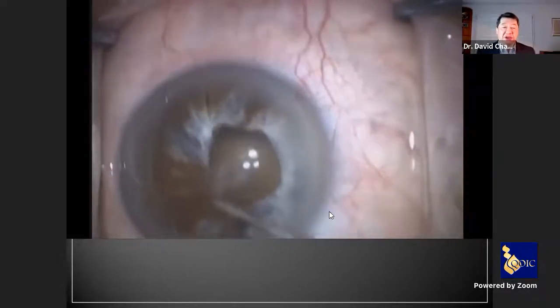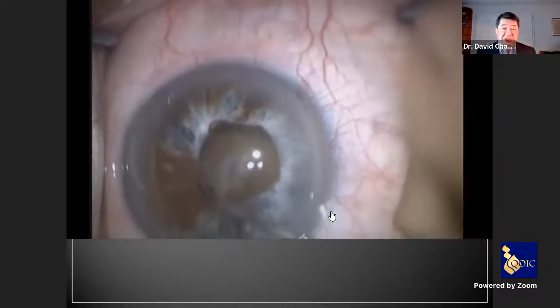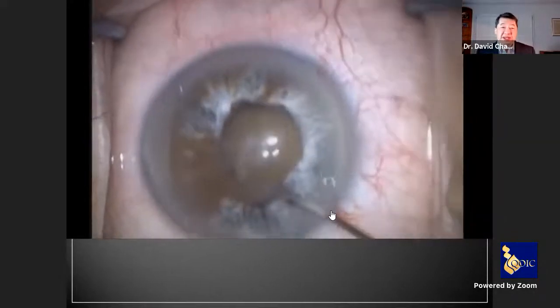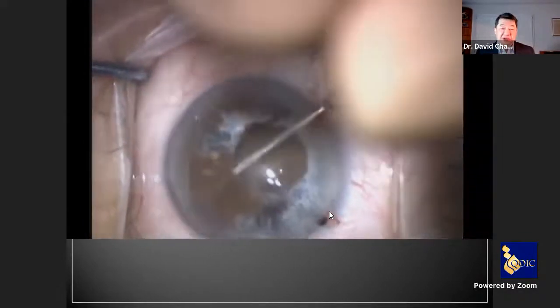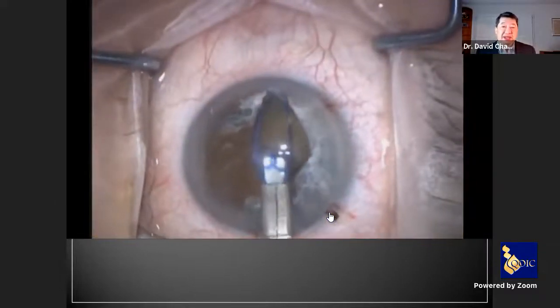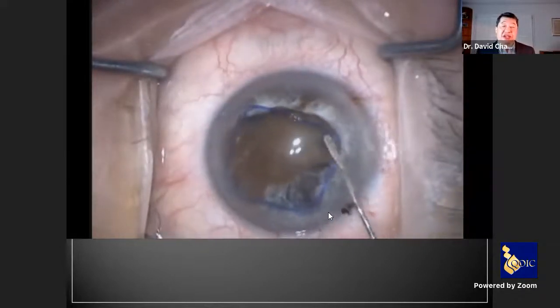Now the second challenge is we don't have just posterior synechiae. The iris stroma has been adherent to the lens because the lens is so forward. When I go in with the spatula, look at the bottom of your screen, you will see that it's very transparent. You see the spatula through the iris? That's how atrophic it is. So this is going to tear very, very easily, and that's why I'm not going to use iris retractors. I'm going to instead use a Malyugin ring because I think that while the case is going on, it's less likely that the pupil gets stretched any further.